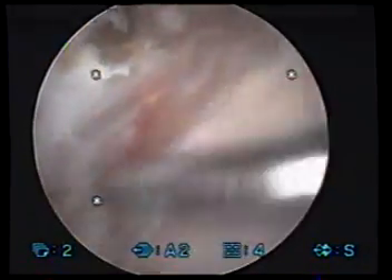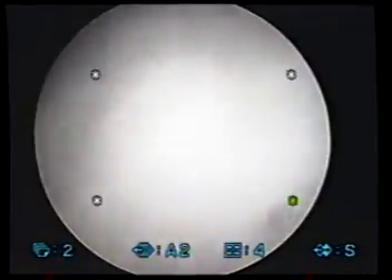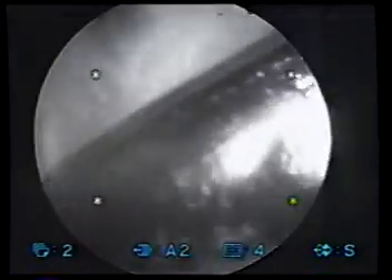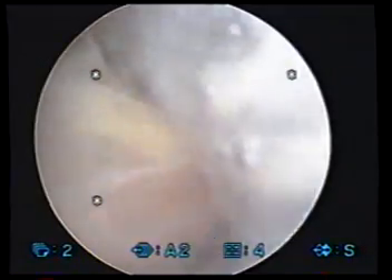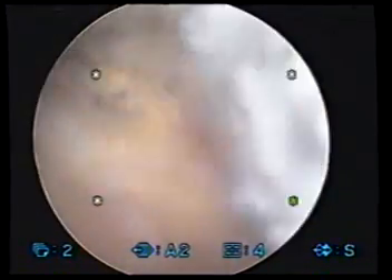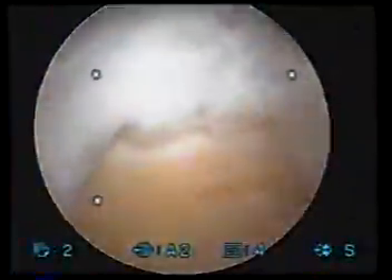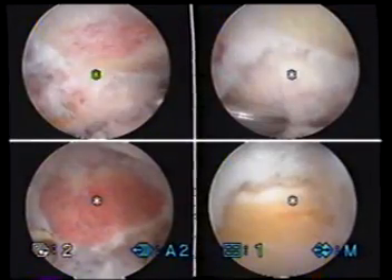We can assess what kind of damage there is here. Very clearly from the other side, we saw a very significant partial thickness tear. My expectation is it's going to communicate here with the other side. We're going to have to sew that back together. We'll expose that and bring it back up on video. This is what that thick, swollen bursa looks like. Here's the rotator cuff tear you have right there. That's the one we're going to be sewing back together for you today.